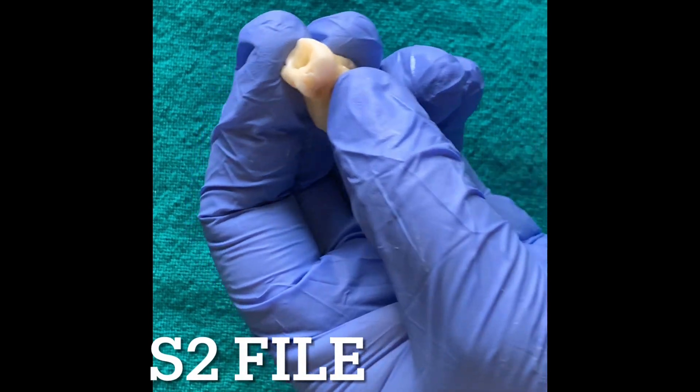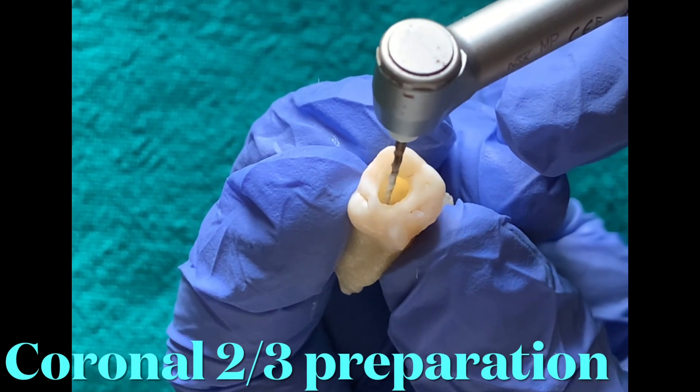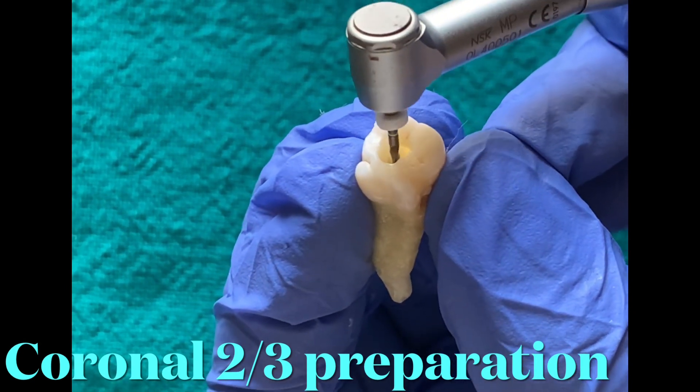The S2 file is used in a manner similar to the S1 file. It actively cuts the middle one-third of the canal, and together S1 and S2 cut and prepare the coronal two-thirds of the root canal.